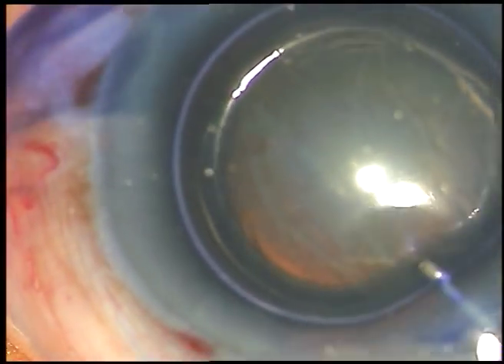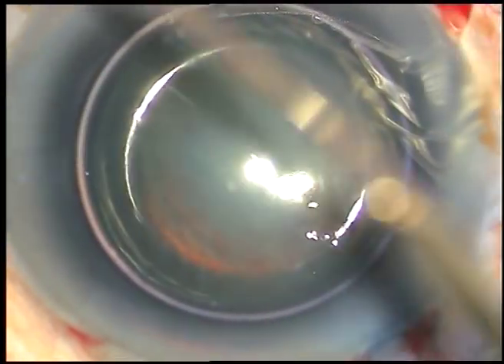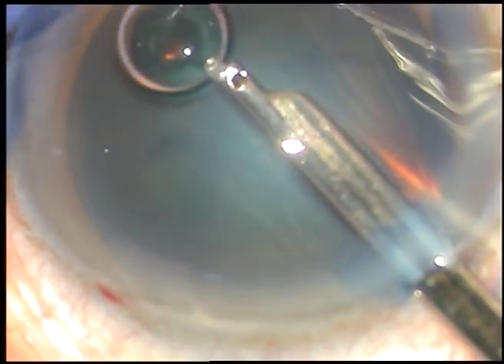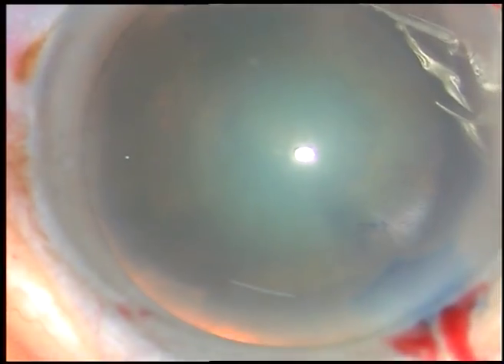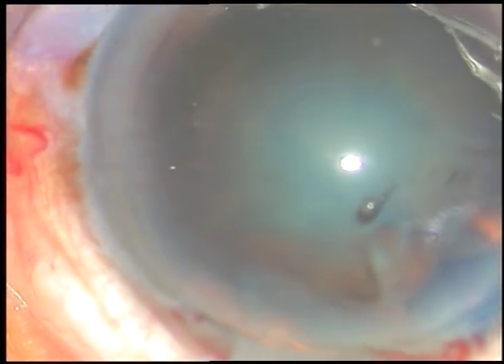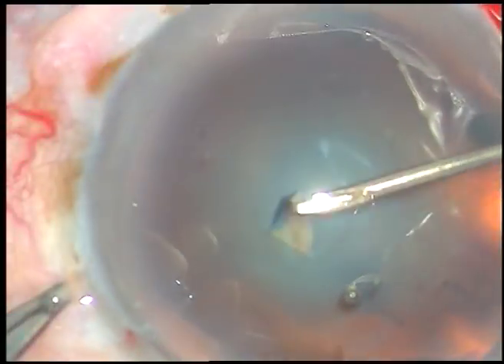Now the dye is washed out. A little bit of adrenaline has been injected underneath this air, and then the dye and adrenaline are washed out. Since I use adrenaline underneath an air and wash out immediately, I dilute the adrenaline only 50:50 — that means 1 to 1.